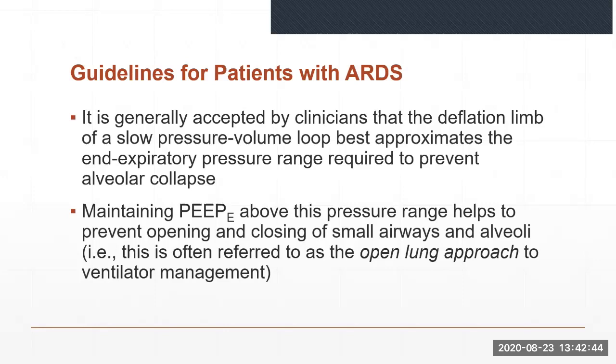Extrinsic PEEP is required for the management of ARDS to prevent the opening and closing of alveoli during each breath. This opening and closing can cause lung injury from the shear stress or frictional forces between alveoli that have different time constants and may also result in surfactant being milked from the alveoli.